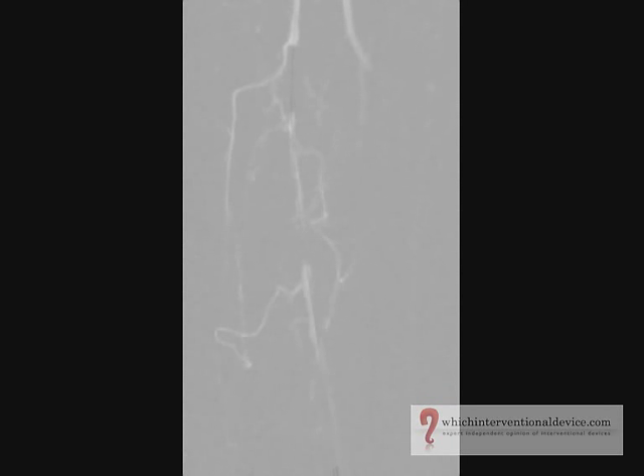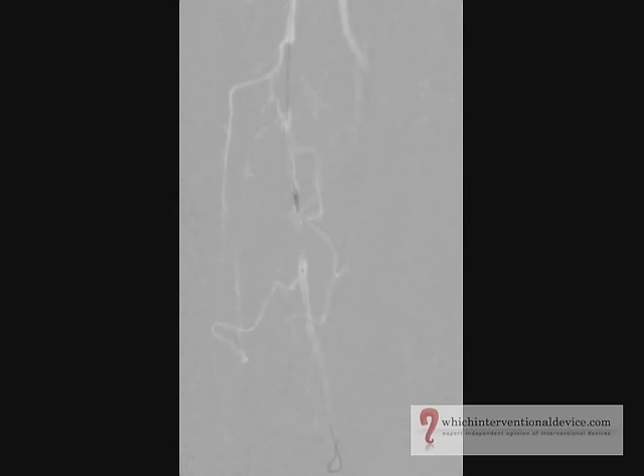A gentle test injection of contrast will confirm this. The catheter is removed over the guide wire and an angioplasty balloon advanced. On this occasion it's a Biotronic Passio 4 French 018 system, and the balloon diameter is 6mm and is 4cm in length.